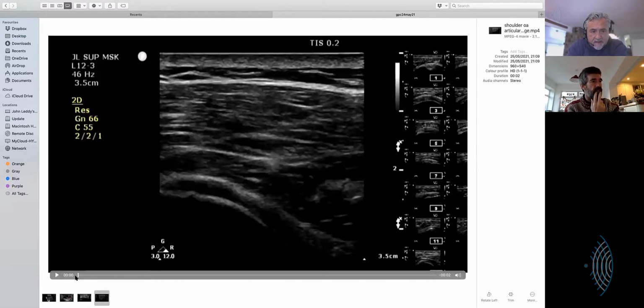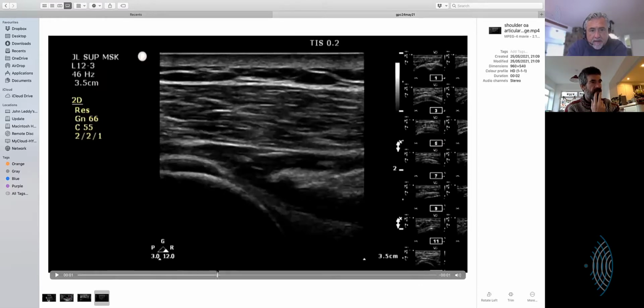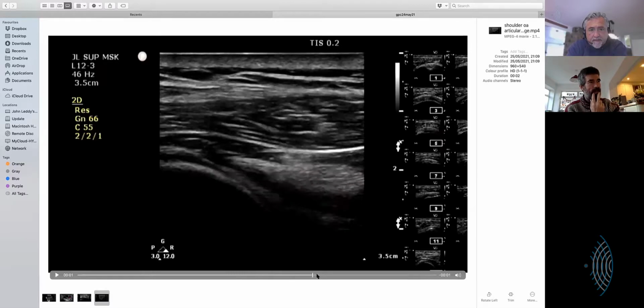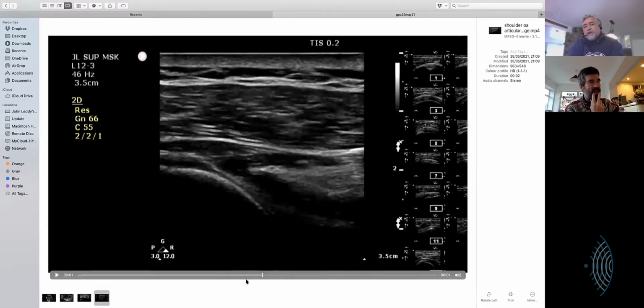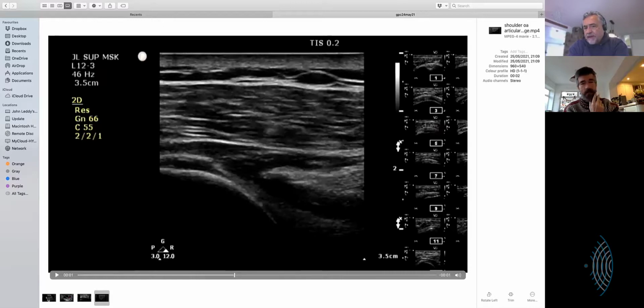So let's have a look. So yes, look at this humeral head. See the cartilage going? Yes. Sort of thing you could so easily walk past and not notice. And do you figure this is the wear pattern from where it actually is making contact with the glenoid?